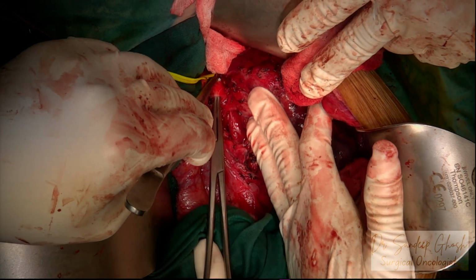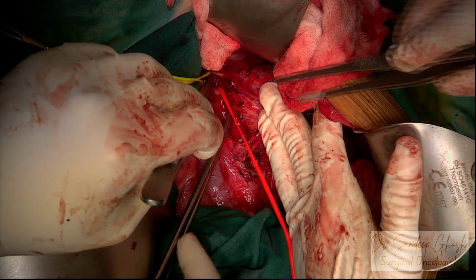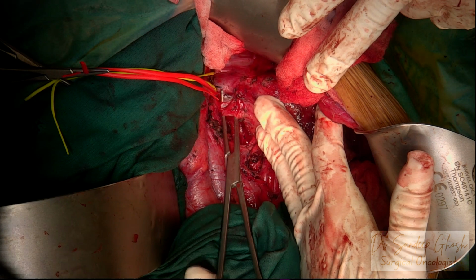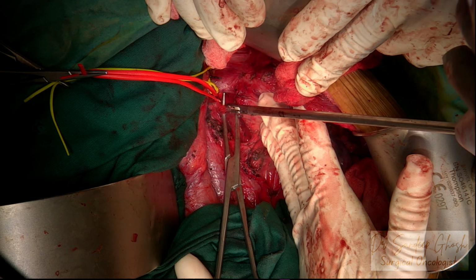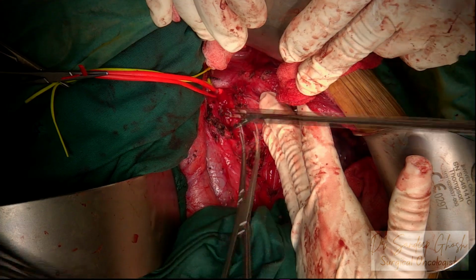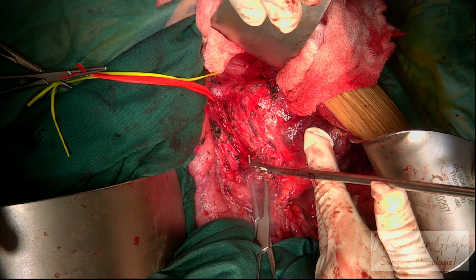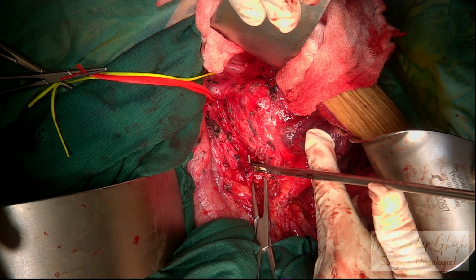Now we have taken control of the renal vasculature, both the renal artery and the renal vein are in our control. Now we gradually again proceed with our paraaortic area dissection, separating the aorta and creating a space between the aorta and the tumor. In this region, usually the lumbar vessels will be encountered, and they are usually small and can be taken care of with a ligature.